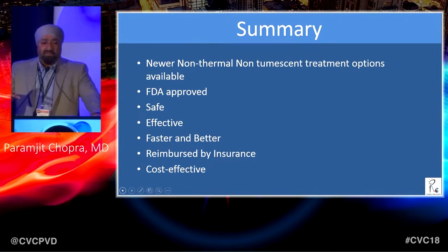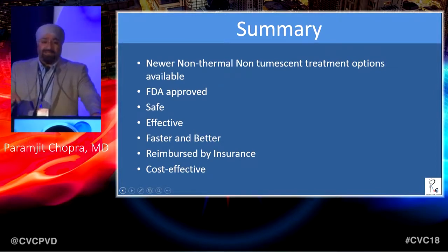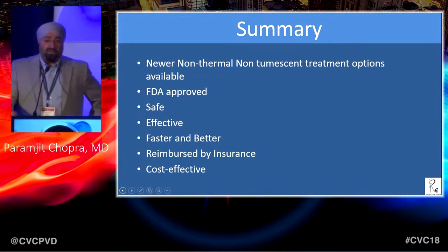In the ones that have CEAP 2 and they have telangiectasias, when I inject it with the ultrasound, I'll make sure the foam gets into all of those. But in my mind, compression following this, good compression therapy is the key for good results, number one. And number two, good follow-up so that as and when they get some coagulum in some spot, catch it early before it's very organized. Often just an 18-gauge needle releases it, pressure's gone.